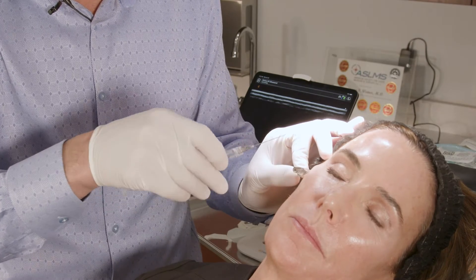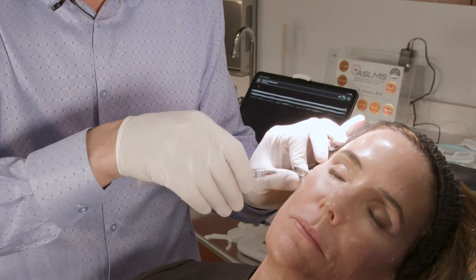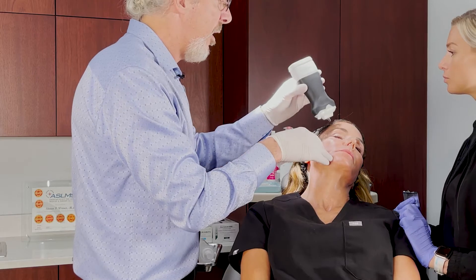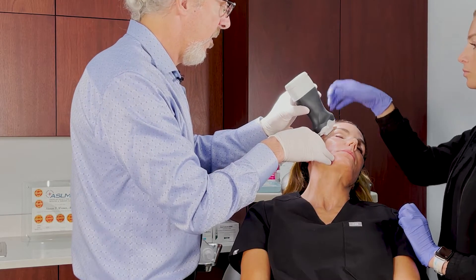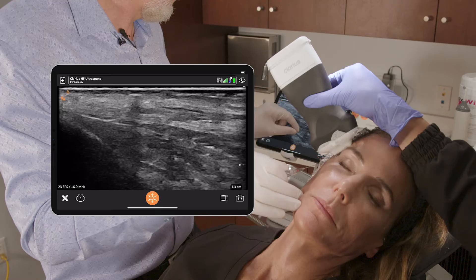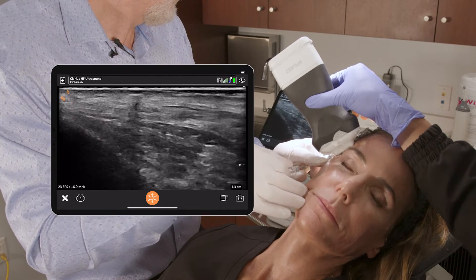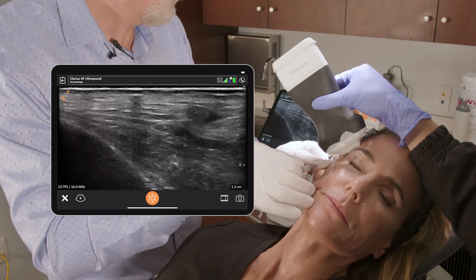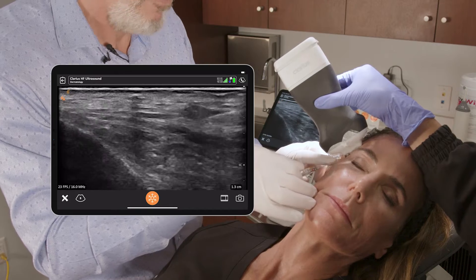I enter just through the skin and place the cannula using the easy guide into that space. Now we're going to use ultrasound — whenever you find what you're looking for, you can use ultrasound to confirm placement.